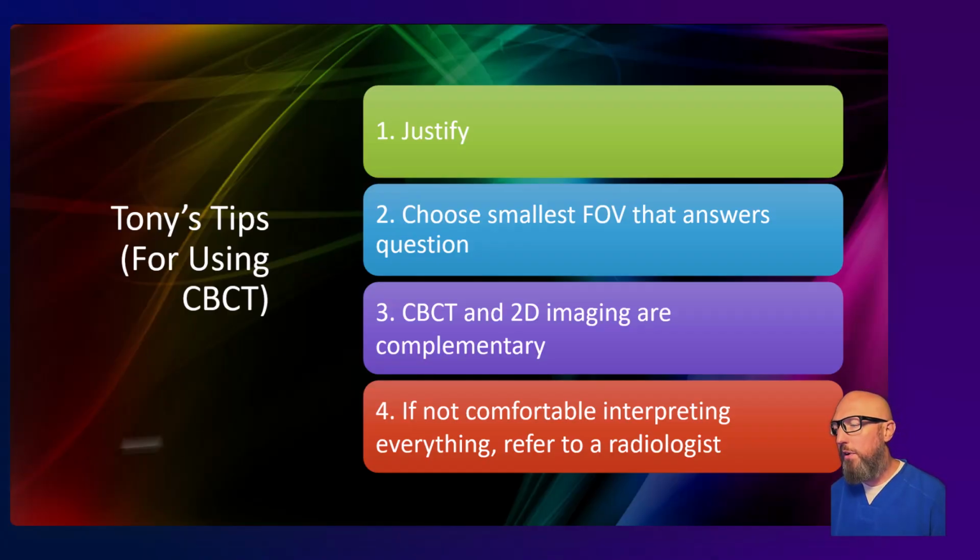Tip 4, if you're not comfortable interpreting everything in a scan, refer it for a radiology read. We talk about legal responsibility for everything in the volume in the 3rd video, and this is real. I've seen too many cases where this has been ignored and things have been missed, and that is an impact to the patient, the patient's families.